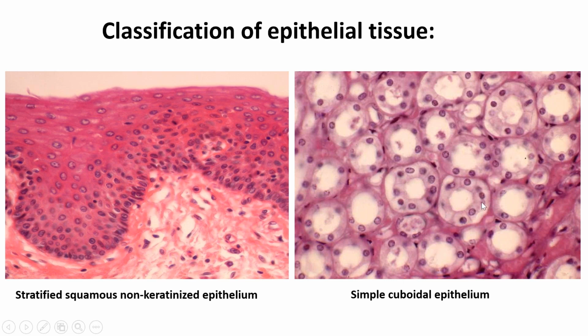Now, as we look around, you go, wait, here's a cell that doesn't have a nucleus. Over here's a cell that I don't see the nucleus. And so we're not alarmed by that because of the plane of section. So we need to be mindful of that. In a plane of section, we may not see all the cellular detail that we would like to.